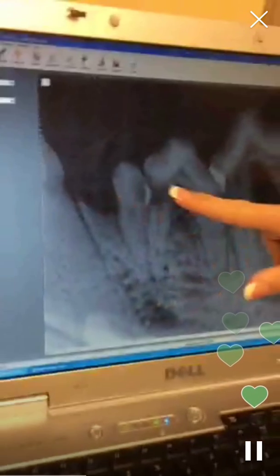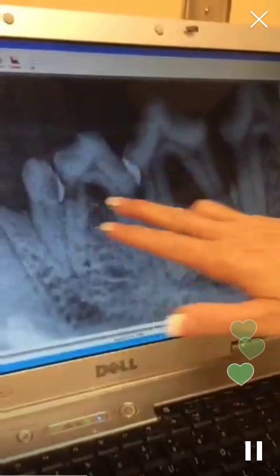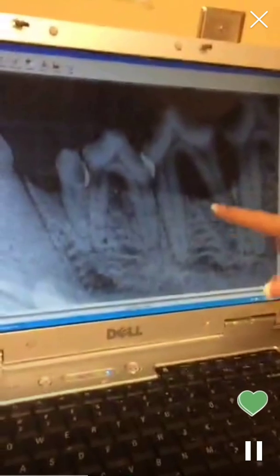So now we're looking over at the left side. Here we have more action, more decay. So bone loss here, and again, that should come all the way up through here. So you can see all the bone loss and all the roots starting to become exposed. And we had almost bone loss all the way to the tip of this root here.